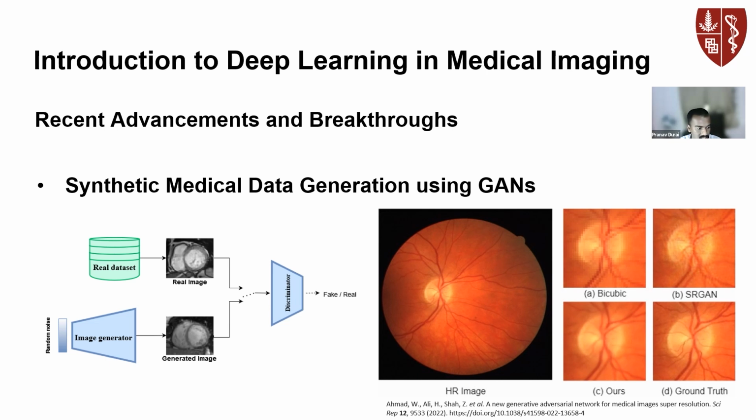So you have over here a high resolution image, and there are multiple implementations of these image generation models. You have a bicubic method over here. You also have an SR GAN. SR stands for super resolution GAN. You can see that already SR GAN is better than bicubic. You can see some kind of pixelations over here, but SR GAN looks more natural.